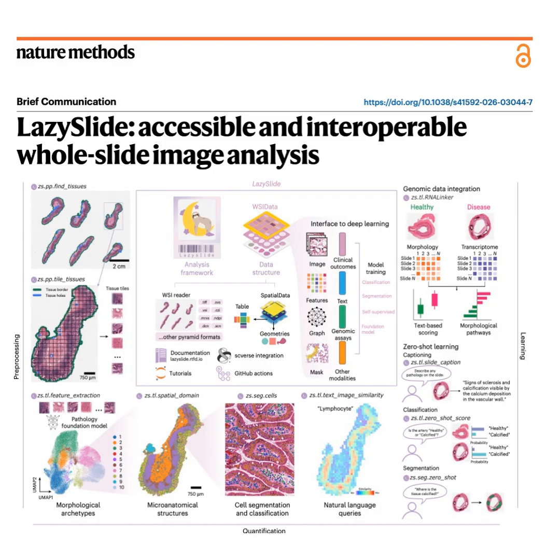Right. And if you are doing downstream single-cell analysis, this double counting entirely corrupts your data matrix. It's been a massive issue in spatial biology. So how does LazySlide fix it? It solves it using a highly efficient spatial indexing algorithm known as an STR tree. That stands for sort tile recursive tree. Okay, break that down for me.